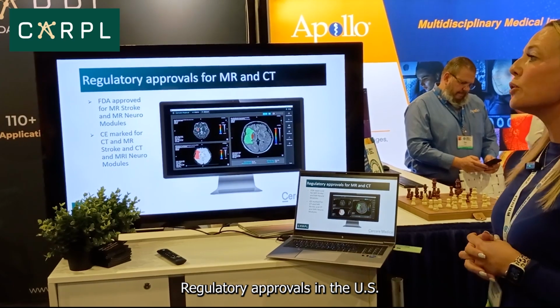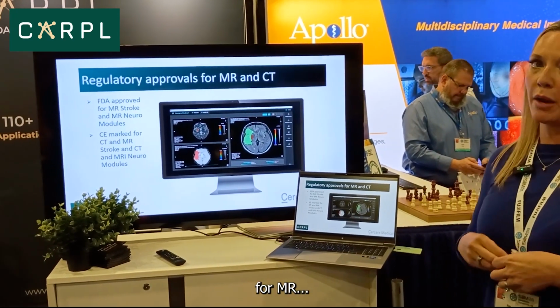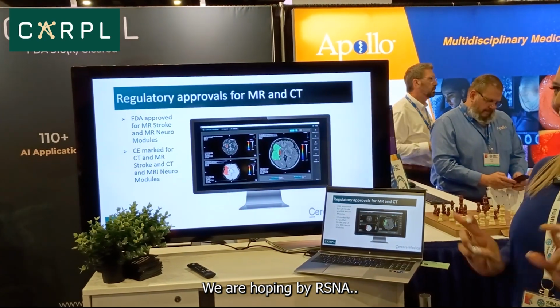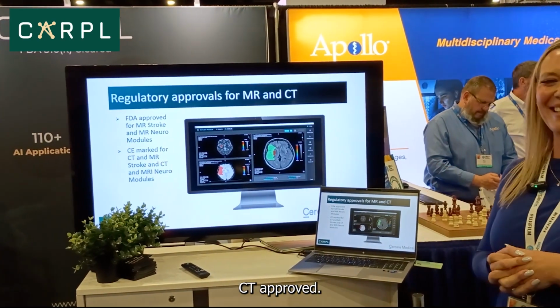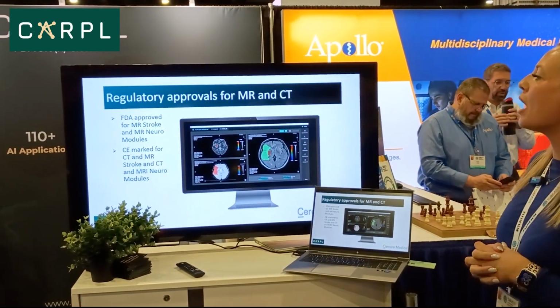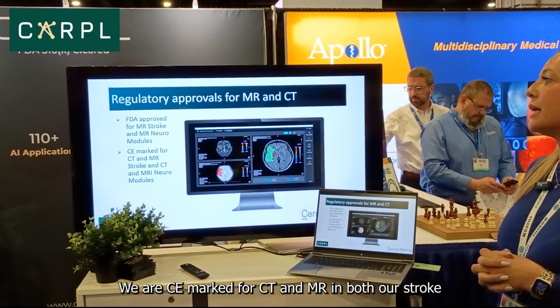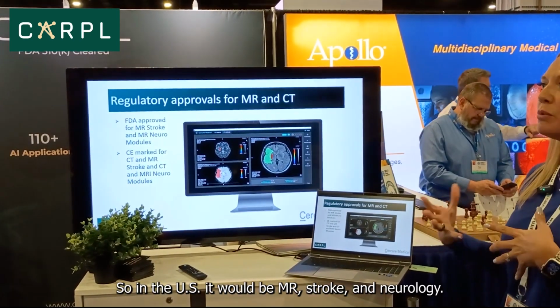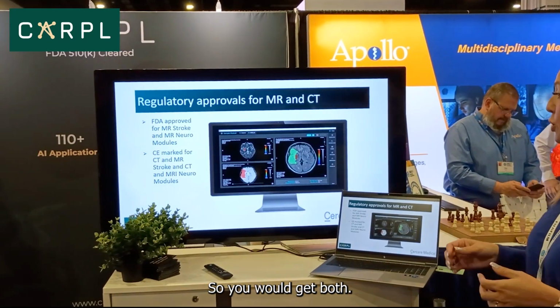Regulatory approvals in the US: we are FDA approved for MR. Our CT has been filed. We are hoping by RSNA we will be fully CT approved. We are CE marked for CT and MR in both our stroke and neurology models. So in the US, it would be MR, stroke, and neurology. So you would get both.